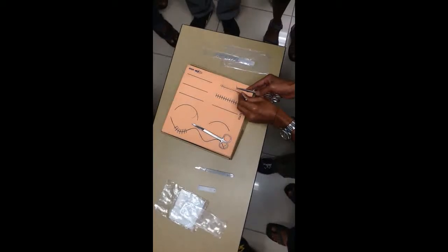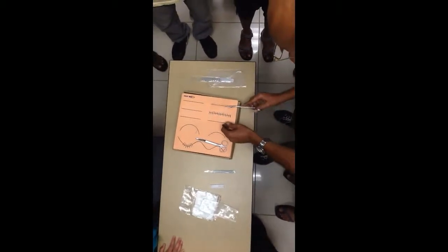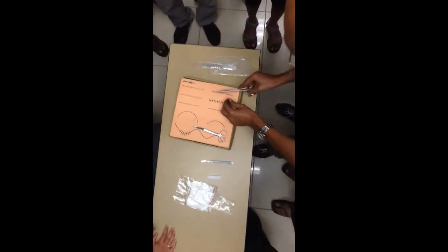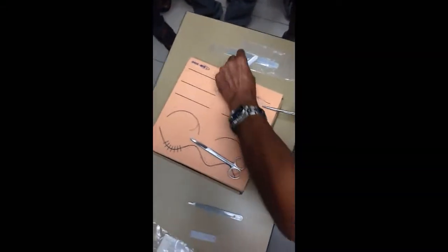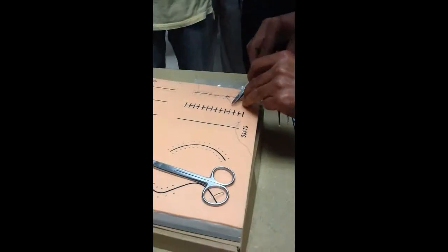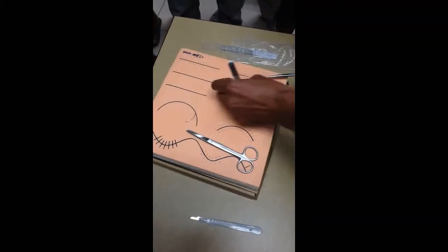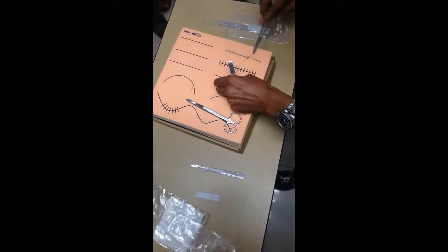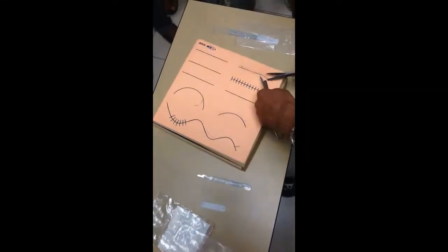I'm going to finish now because the loop is becoming very small. I'll have to tie a knot here, so this is where I'll finish. I'm assuming that I've reached the end of my linea alba. Now, I will not completely tighten this last bite — instead, I'll keep it a little loose. Watch: make a loop here, catch hold of this, pull, and it becomes a knot. Then take the reverse, catch hold of the tip here, pull, and it becomes a knot. Then catch here and put multiple throws. There we go, and we are done. I'm assuming we've reached the end of our linea alba, and we cut it off.